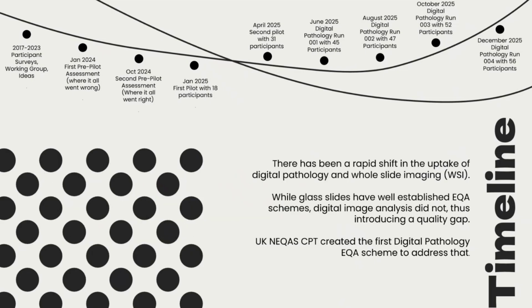So we know there's been a rapid shift in the uptake of digital pathology and whole slide imaging. And while glass slides have well-established EQA schemes, digital image analysis did not have this, so we had that gap in quality. So that's why we developed this scheme.